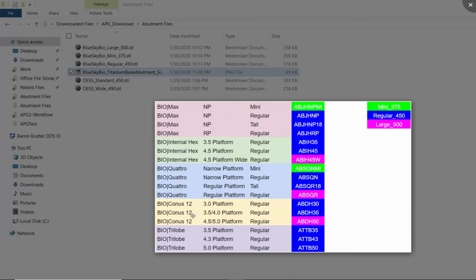Actually, I can't remember if it's TX or TC. I apologize, but it's one of those. You've got various ones to pick.